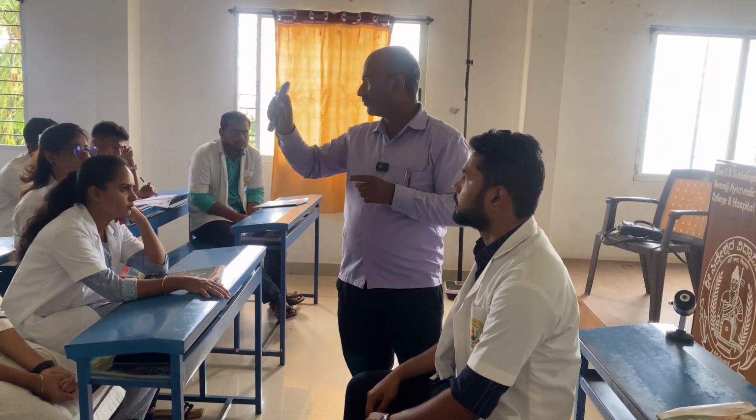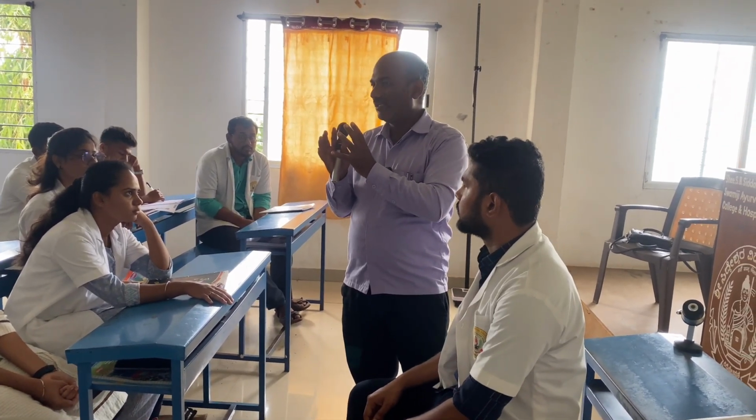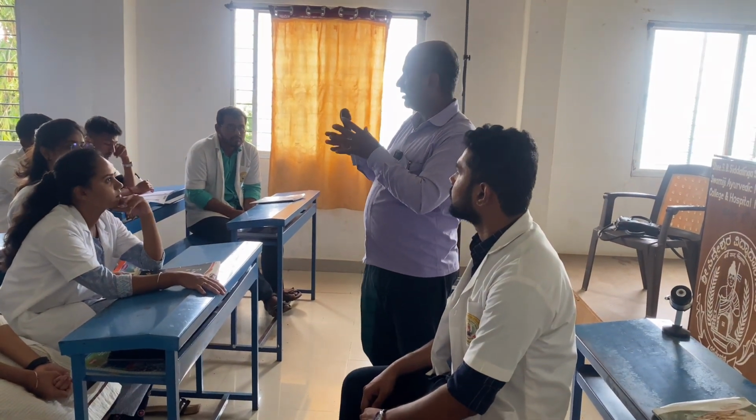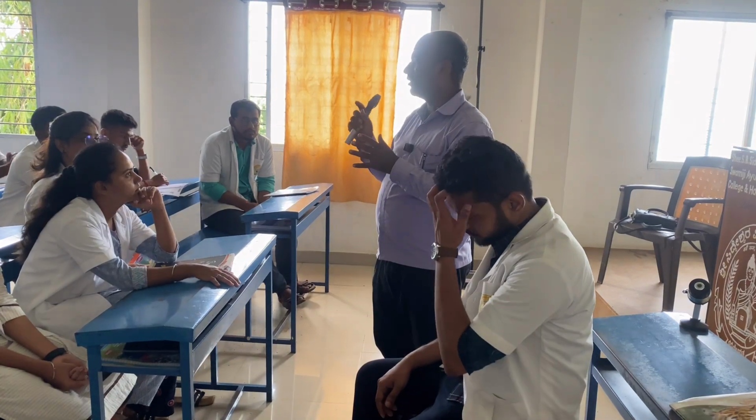Where is it going, up or down? Have some bundles formed? That is, there are new vessels formed along with the bundles of the blood vessels. That is called neovascularization.